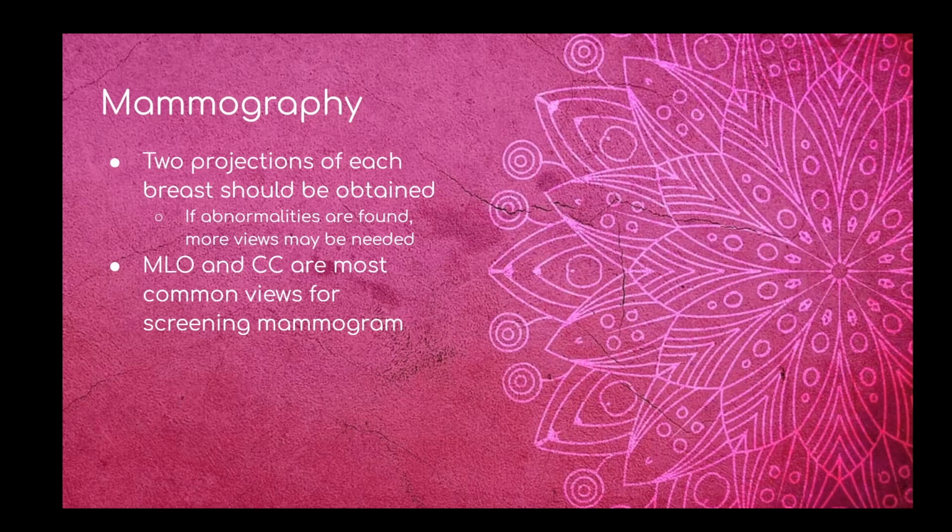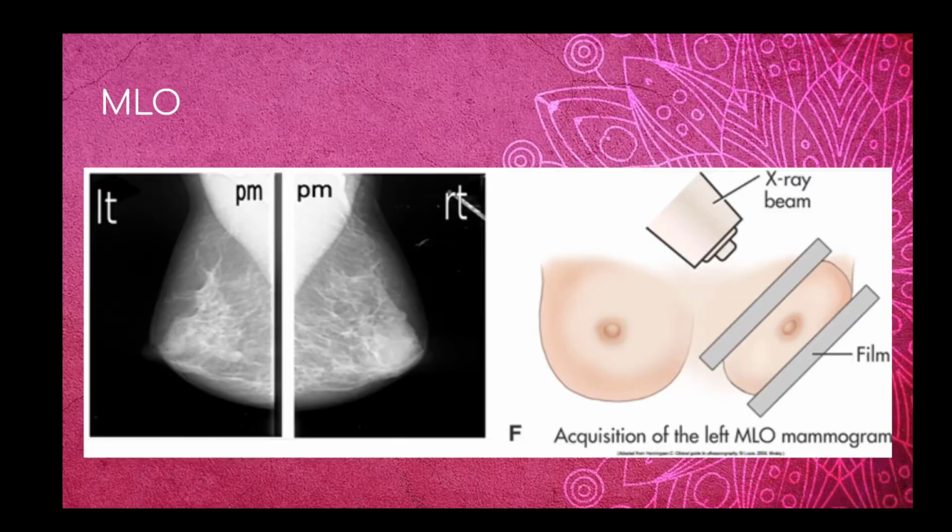But mammography and ultrasound go together well, especially for the breast. And with mammography, they do 2 projections of each breast. The MLO and CC views are the most common for a screening mammogram. So our MLO view takes the breast and almost moves it into a vertical position. So we can see we have our breast hanging in the natural position. The paddles then are compressed and they twist the breast up. So now the lateral side of the breast is higher than the medial side of the breast.